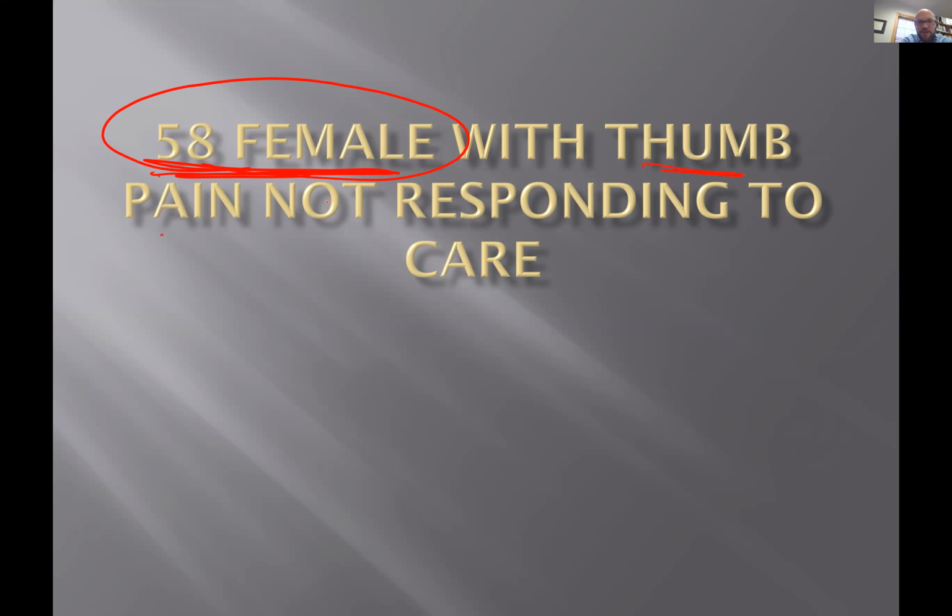Thumb pain. You know, guys, if you send me an x-ray and you say, hey, Dr. Rich, can you take a look at this x-ray for me, and I write a report up for you. You say, hey, there's a history of trauma, I get a little nervous. You say, there's a family history of cancer, maybe. Well, that's pretty common. You say all these things trying to get me worked up on the transmittal form that you send in. Doesn't really work me up much. Here's what works me up.